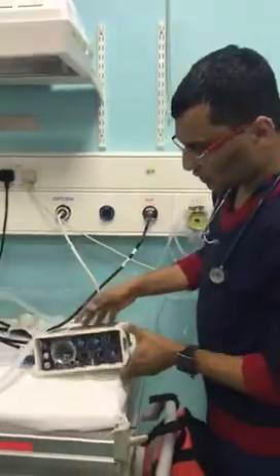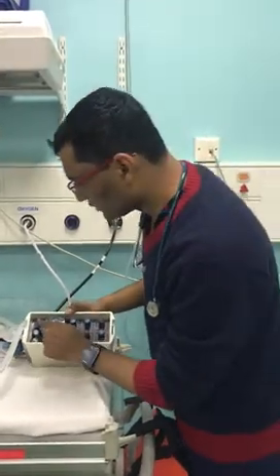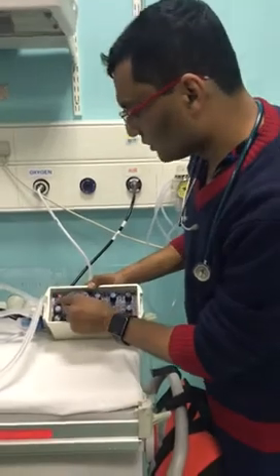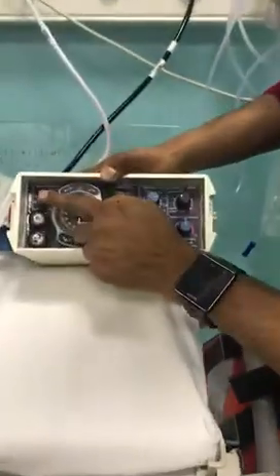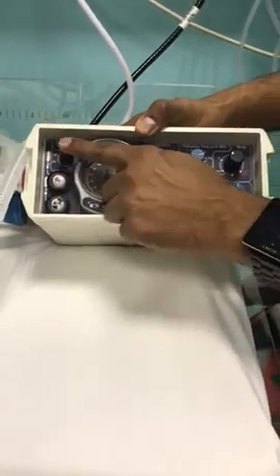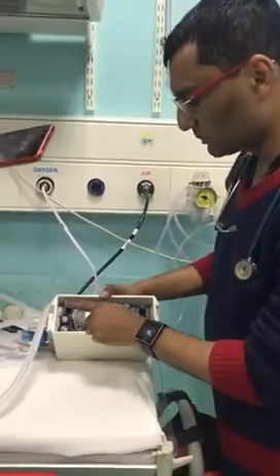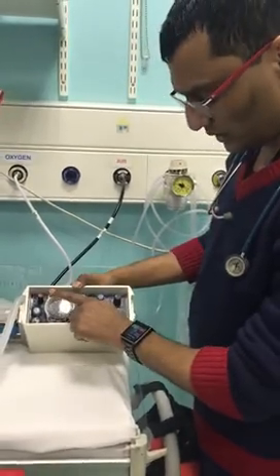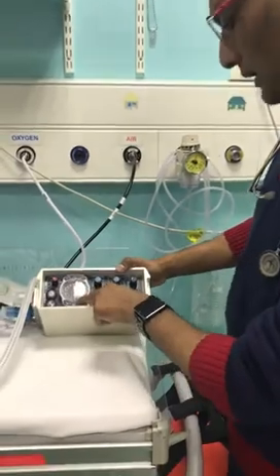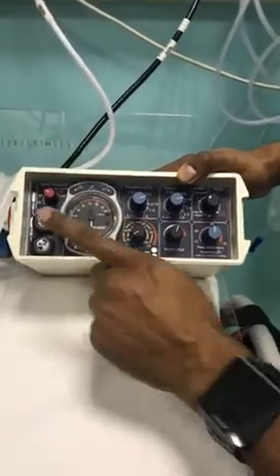Looking at the dials quickly: the first one is the most important — the alarm pressure. Make sure it's never set more than 30, unless you intentionally go up on that, otherwise you will cause a pneumothorax. 30 is quite a high pressure for normal lungs. You may intentionally want to increase it a little bit. The second dial goes up for PEEP and PIP — we'll see that in a minute.